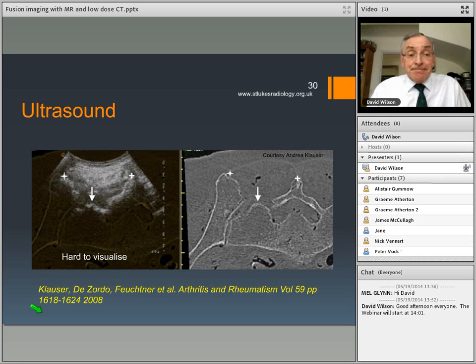Problem is, your needle's pretty well likely to come in at 45 degrees at best to the angle of the beam, and so it's very hard to see the needle tip. Well, there is a way around that.